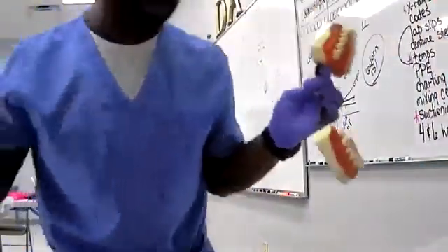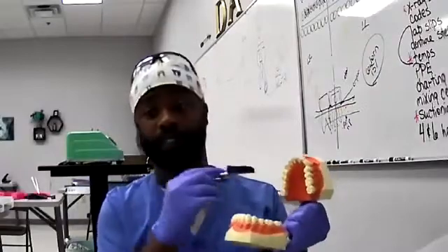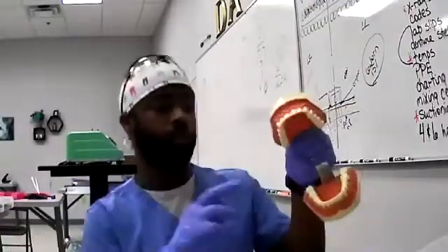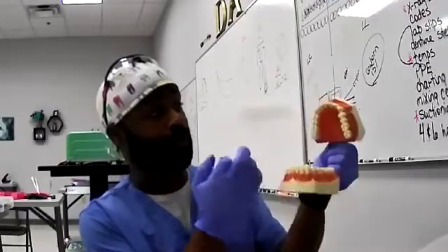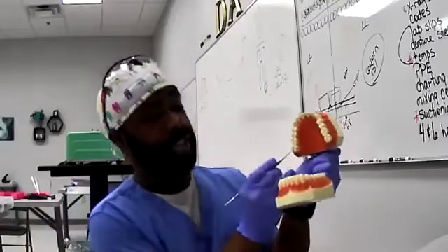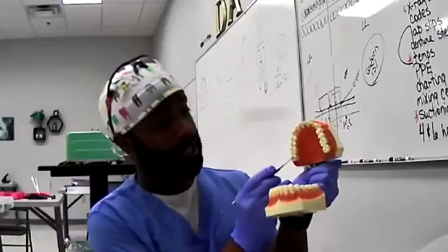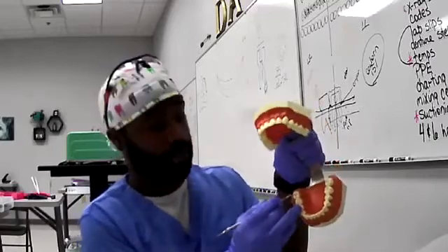So now you know exactly where you have high points on the opposing tooth. Because remember, we feel this tooth, but this tooth is marking. So you get to see on the opposing tooth where your hot spots are on the bottom tooth. So what you do is just go ahead and get your high speed and you tap on the opposing teeth. Little bitty taps, then you can go back down to the actual tooth that we prep.